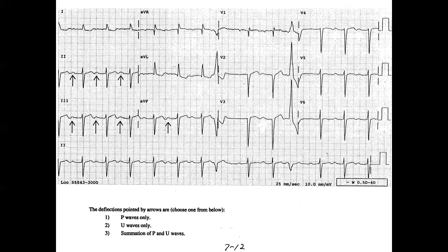Look at V3. Where is that P? P is not there. So this patient is a very kind person. And knowing that we are struggling, she says, okay, I'm going to help you, Jeremy. I'm going to help you by making my P wave in V3 isoelectric.